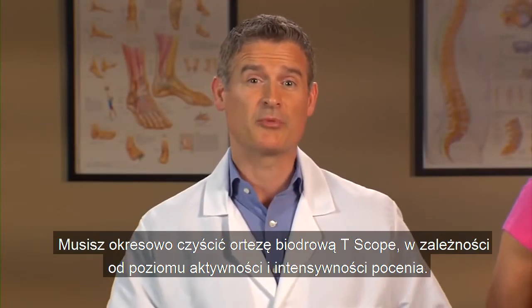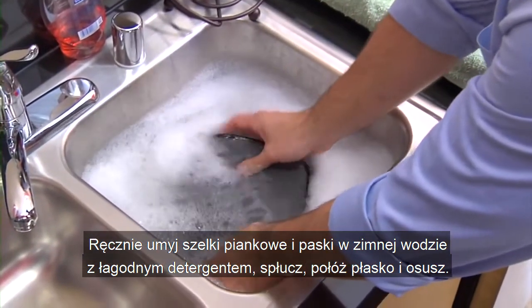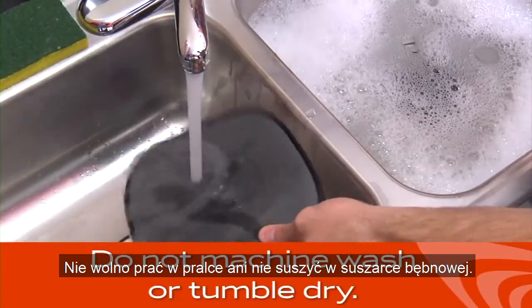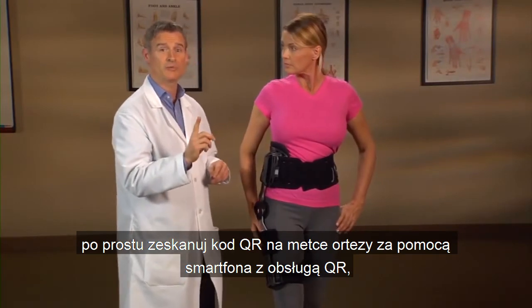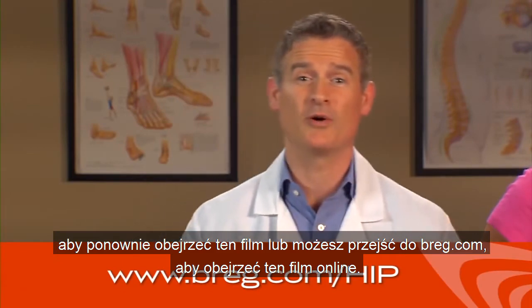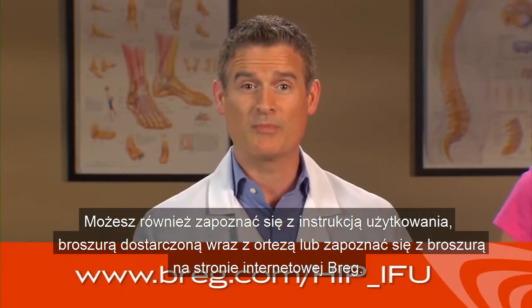You'll need to clean your T-Scope hip brace periodically depending on your activity level and how much you perspire. Hand wash your brace's foam pads and straps in cold water with a mild detergent. Rinse, lay flat, and air dry. Do not machine wash or tumble dry. If you need a reminder of how to put on or care for the brace, just scan the QR code on the label of your brace with your QR code-enabled smartphone to view this video again. Or you can go to Breg.com to view this video online. You can also refer to the instructions for use pamphlet that came with your brace or view the pamphlet on the Breg website.